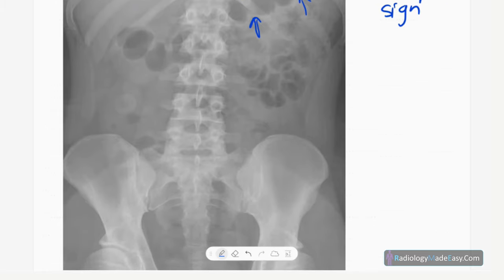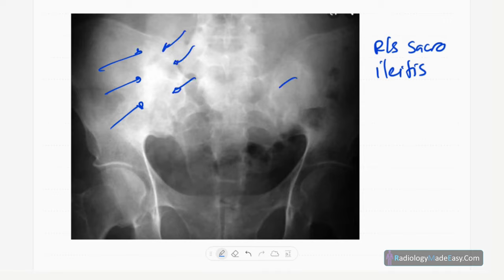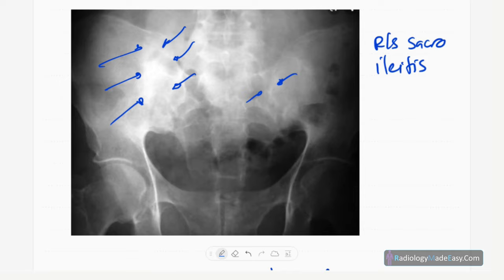This is an anteroposterior radiograph of the SI joints. Both SI joints are shown in this patient. You can see sclerosis and ankylosis — fusion of the SI joint — mainly in the right SI joint, with subtle sclerosis also in the left SI joint. This is sacroiliitis, seen as an extra-intestinal manifestation of inflammatory bowel disease.